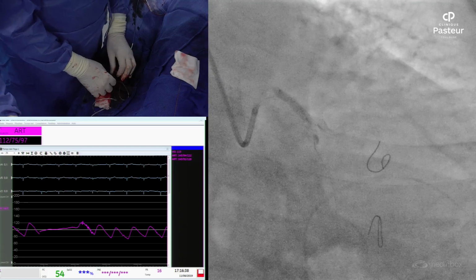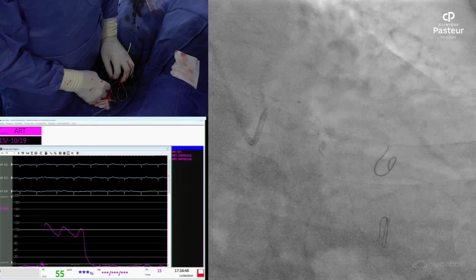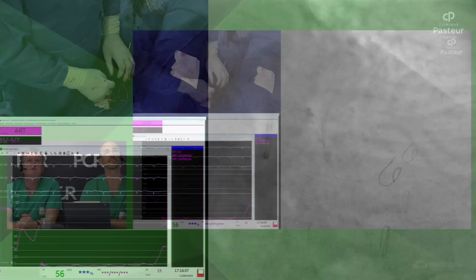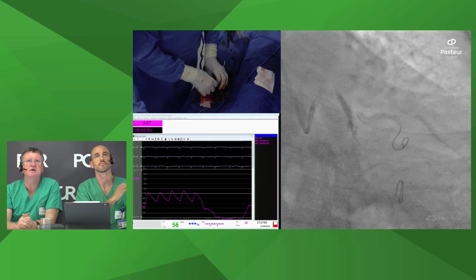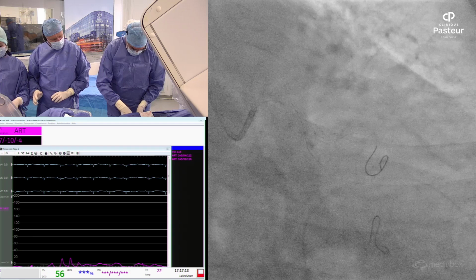The other possibility also is to put a small 1.5 millimeter balloon on the first marginal branch, to make also like a buddy wire, but with the balloon. A buddy balloon, yeah. Go on, 6. One more time, to open the struts. When you see that balloon track down quite easily, you should be able to get a guideliner close to the bifurcation point there, shouldn't you? So, good. So now the stent again. And if not, we do the anchoring.